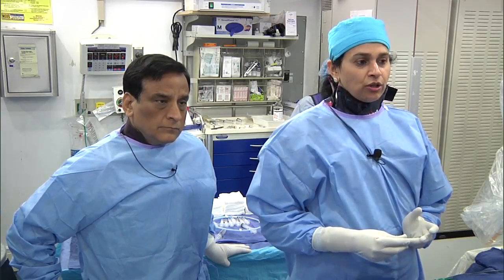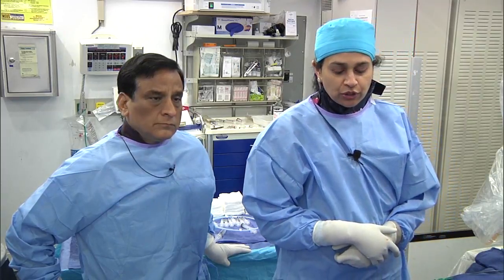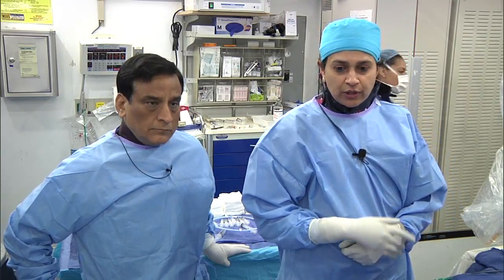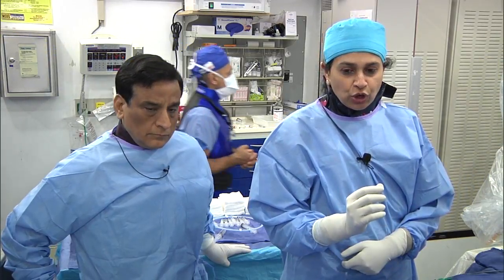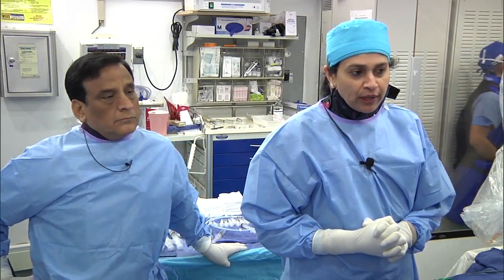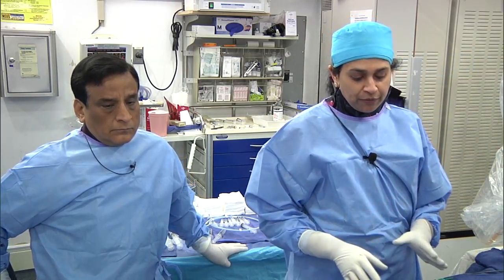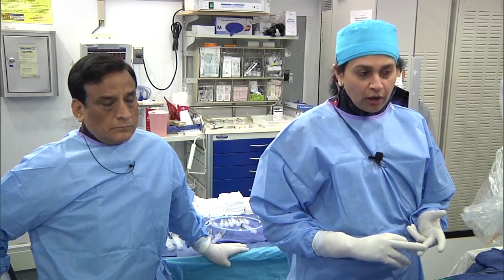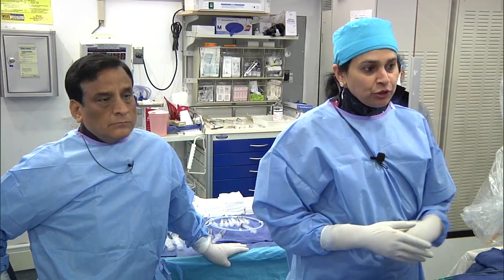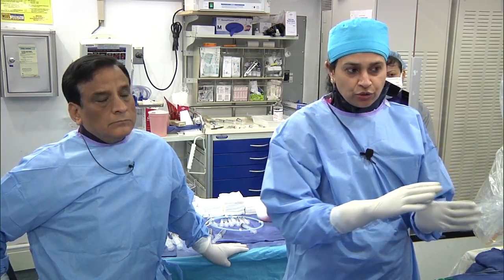If these two are not available, you can still use the Whisper. Now they have a newer one called the Sion. It is not polymer coated. The tip has coils, but it has a hydrophilic coating. It was specially designed just to go through these small channels. But if you have these three wires, which are the regular Fielder, Fielder FC, or your Whisper, we should be able to get through the septals. Those are the wires to get through the septal.